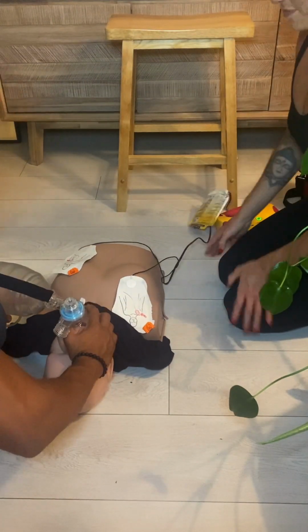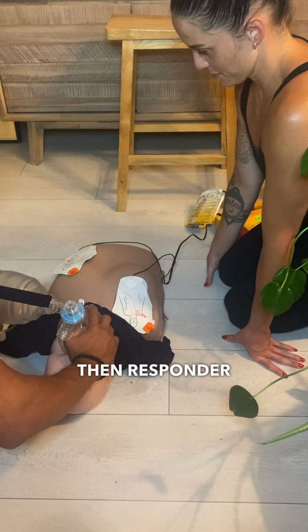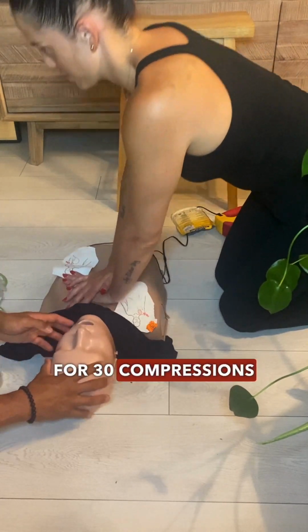Continue for 1 minute. If there was a third responder, then responder 2 will hold the mask in place and responder 3 will squeeze a third of the bag for 30 compressions to 2 breaths.